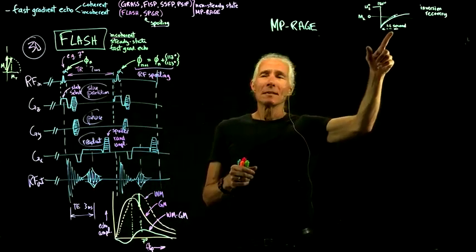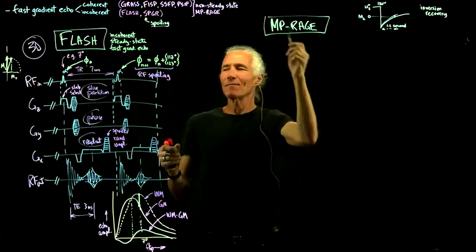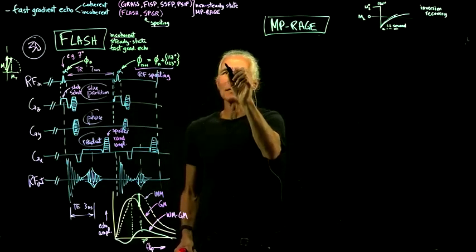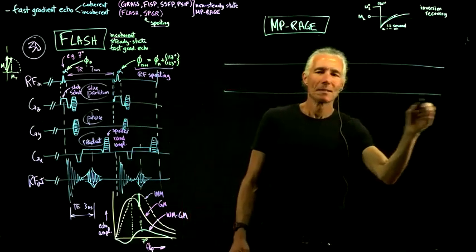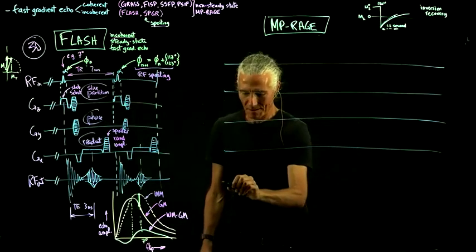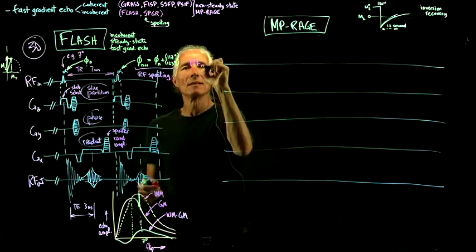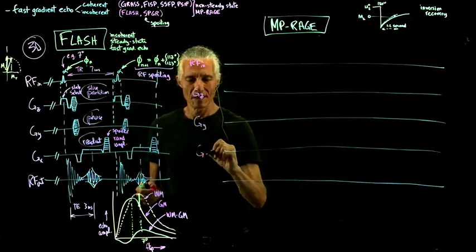But the guys who came up with MPRAGE said, well, why don't we just try to mash inversion recovery into this? So now, let's draw the RF in, the Z gradient, the Y gradient, the X gradient, the signal that comes out, and some space for a graph below.